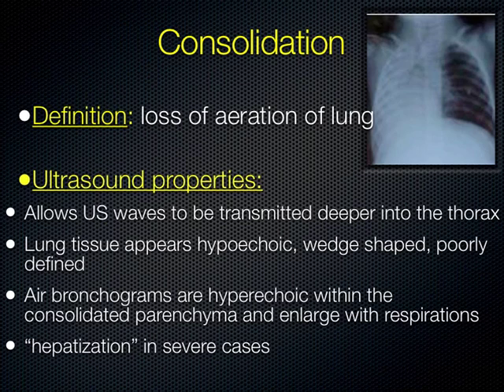If the lung is severely consolidated, it will actually end up looking like liver. We call that hepatization of the lung, which is just a term meaning it's really socked in. With pneumonia, it almost looks like a solid organ, and those patients are generally in pretty serious trouble. Some examples of what it can look like.